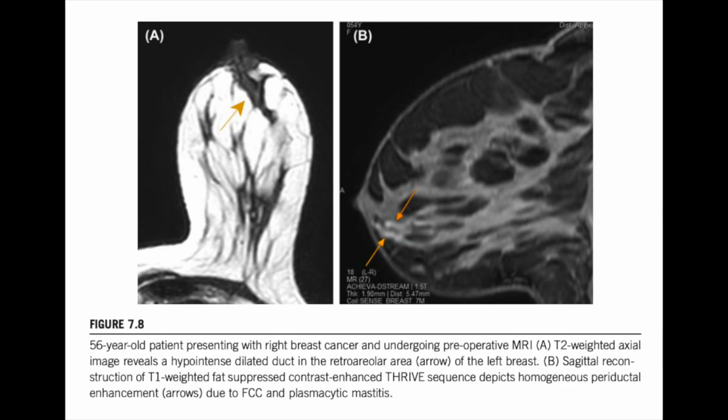But I'm guessing even something common like a fibroadenoma can throw a wrench in this. Absolutely. And this is the kind of nuance that keeps radiologists up at night. Fibroadenomas can have really variable ADC values, depending on what they're made of. Precisely. If an FA is myxoid, meaning it's got a lot of water content, it'll have beautiful high ADC values. Great. That helps you avoid a biopsy.